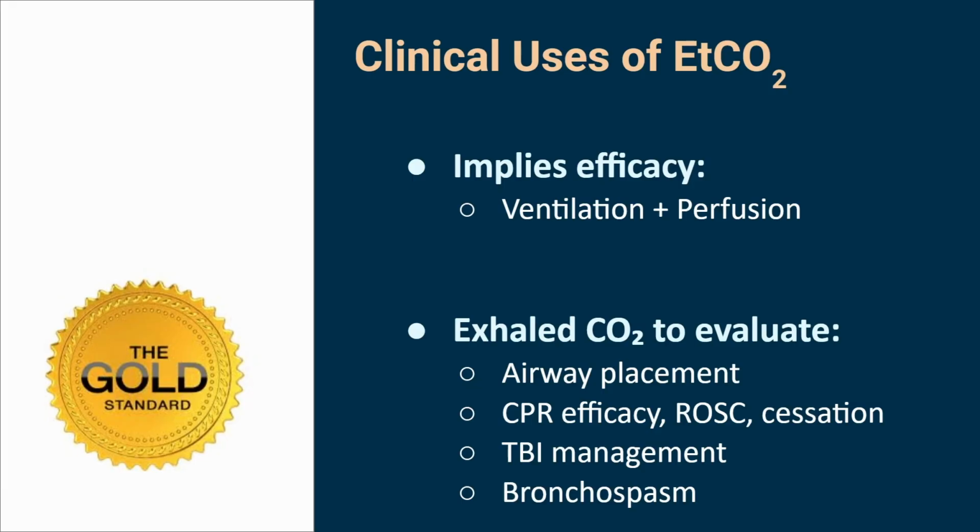But that's usually what happens: people will view the end tidal and say, oh, well, that's it. Basically, a study was done and said, what is the likelihood that somebody survives if their end tidal A, never got above 10, and B, never got above 10 within 20 minutes? If that never happened, it's statistically impossible for them to ever come back to life.